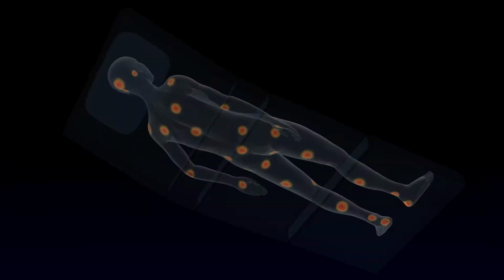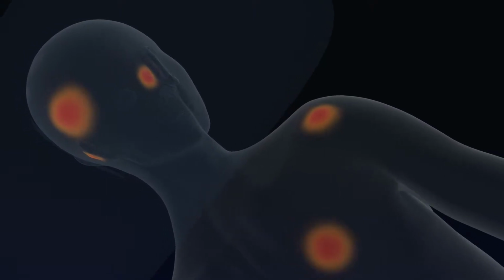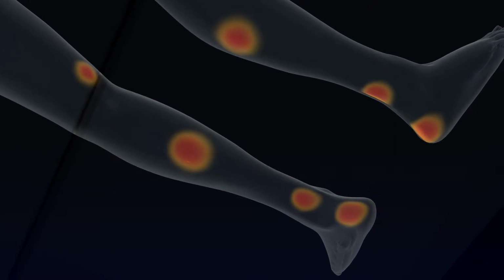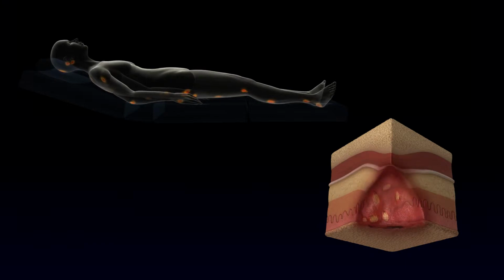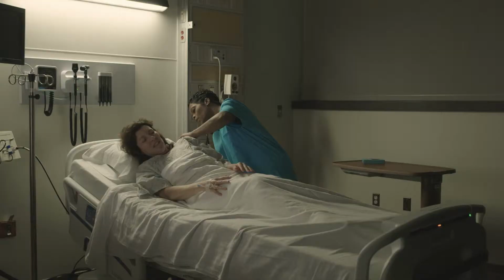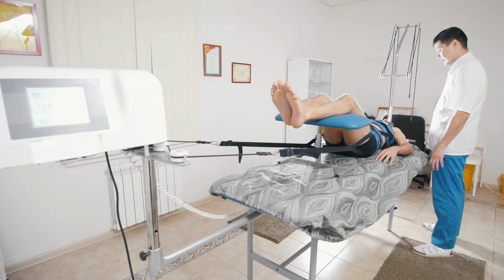In surgical procedures lasting longer than 3 hours, tissue perfusion can be compromised. The inevitable prolonged contact of the body with the OR table creates unrelieved pressure points that are the primary cause of pressure injuries. Perioperative guidelines recommend repositioning the patient every 2 hours. That can present a challenge to staff or is unattainable at times.